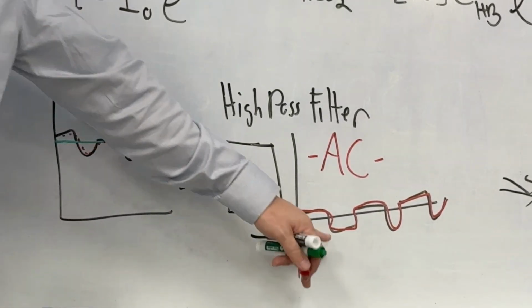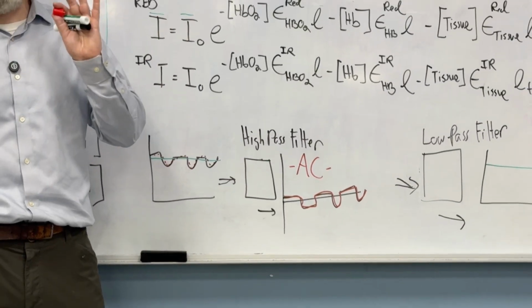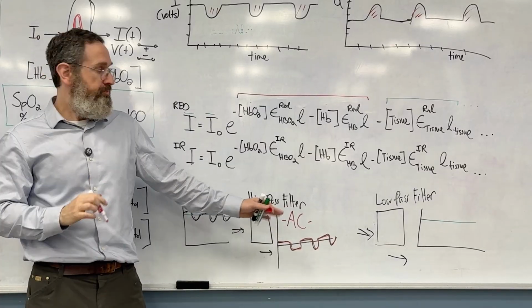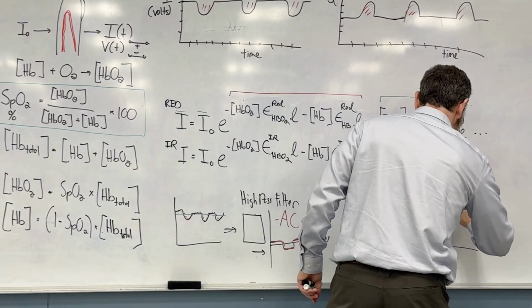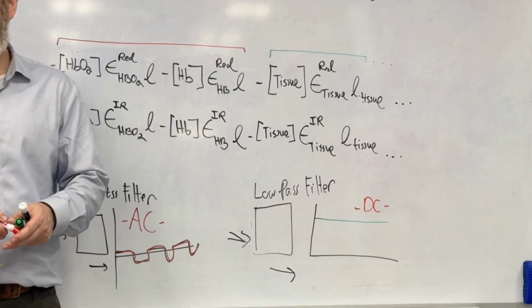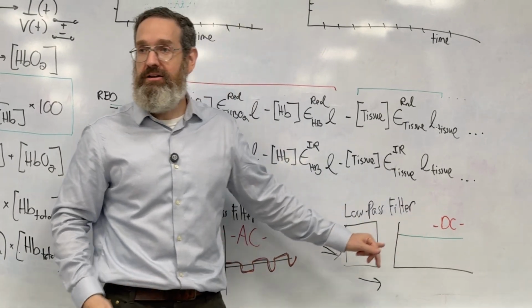Now, it's not a sinusoid, but that's what they refer to. And I want to throw out this terminology. You know I don't give you a lot of terminology, but you can't go out into the world and not know this. And they will refer to this as a DC coupled signal, DC like a direct current, like what comes out of a 9-volt battery.